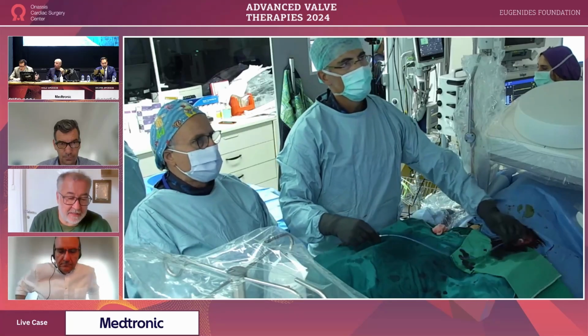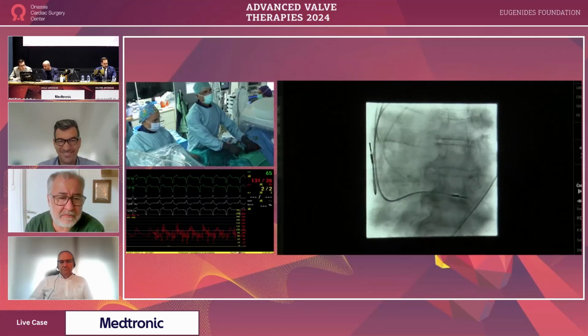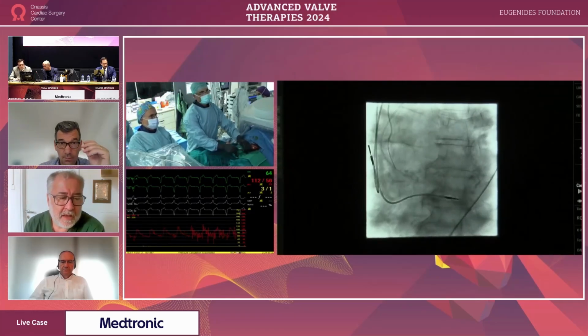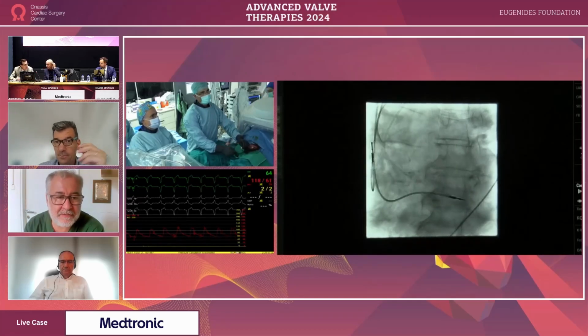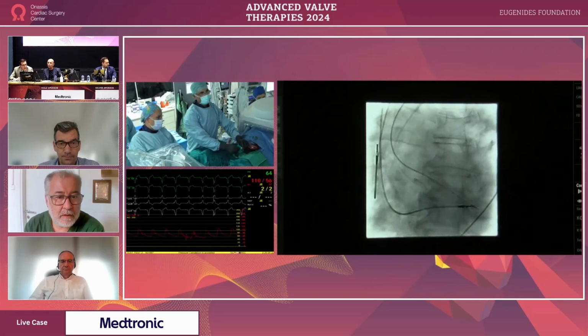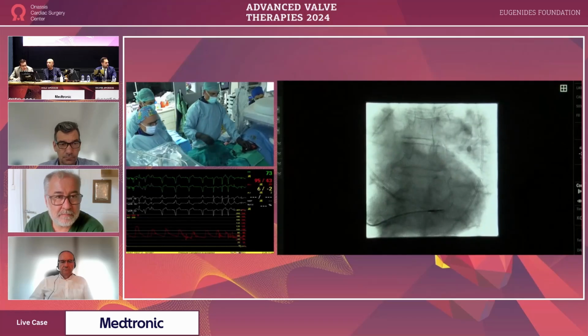Well, the practice in our center is we use fluoro dedicatedly. Perhaps because we started like that, we are very accustomed to it. If we combine the live fluoro, stay with the fluoroscopy while people are speaking. Do not change off the fluoroscopy. You're welcome to use picture-in-picture to show the face, but stay with the fluoroscopy, unless we lost signal.